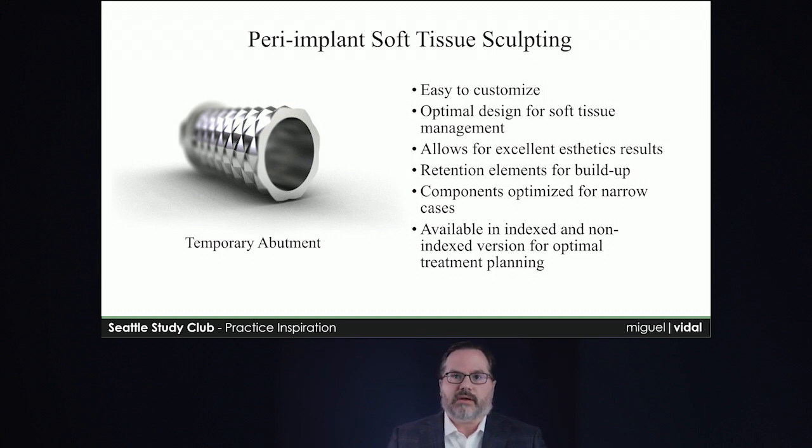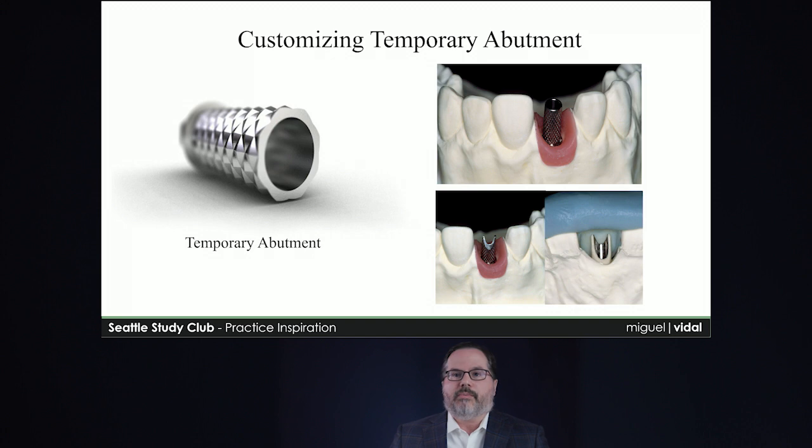There is a PEEK plastic component, but I find the titanium is much more predictable for what I'm trying to achieve. They do impart some grayness sometimes depending on the angulation of the implant, but that can be masked out in the laboratory or clinically by using some masking material.